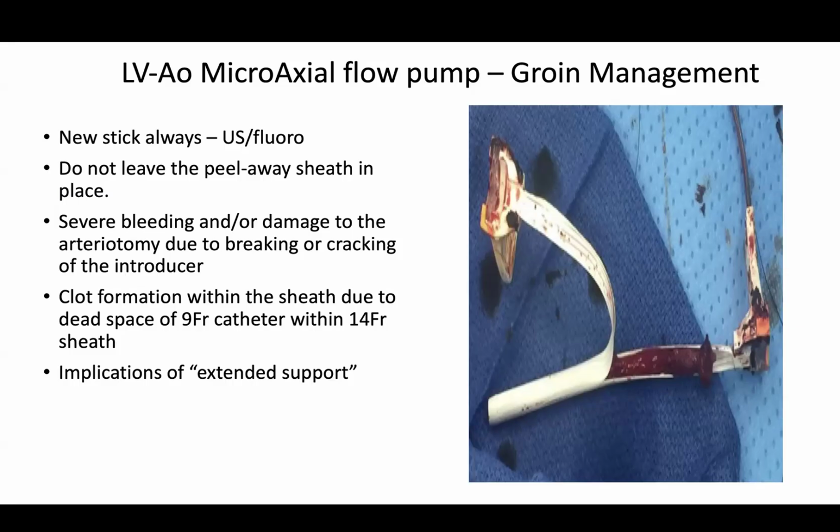And then once you put an Impella sheath in, this is probably the more scary part of the procedure, getting this peel away sheath out. The next iteration of Impella will not have this peel away sheath, but we're still dealing with it. And it was not uncommon to get transfers with Impellas with the peel away sheath still in place. And this is what happened. You have a dead space between the driveline and the peel away sheath, and that clots pretty quickly. And then your risk of limb ischemia goes way higher.